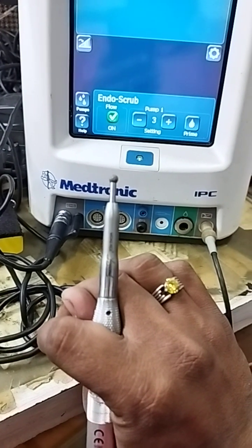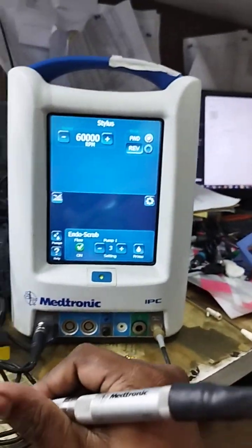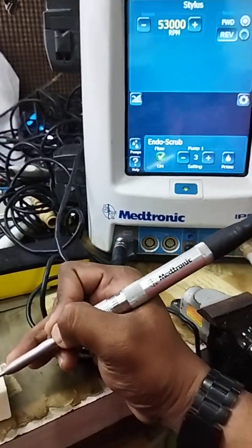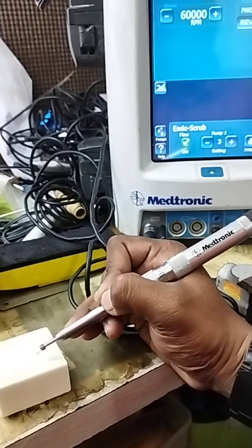The customer was saying the burr is not rotating. After we serviced it, you can see it's now working fine. This problem is due to a poor cleaning method and poor sterilization — that is the only reason this problem happens.